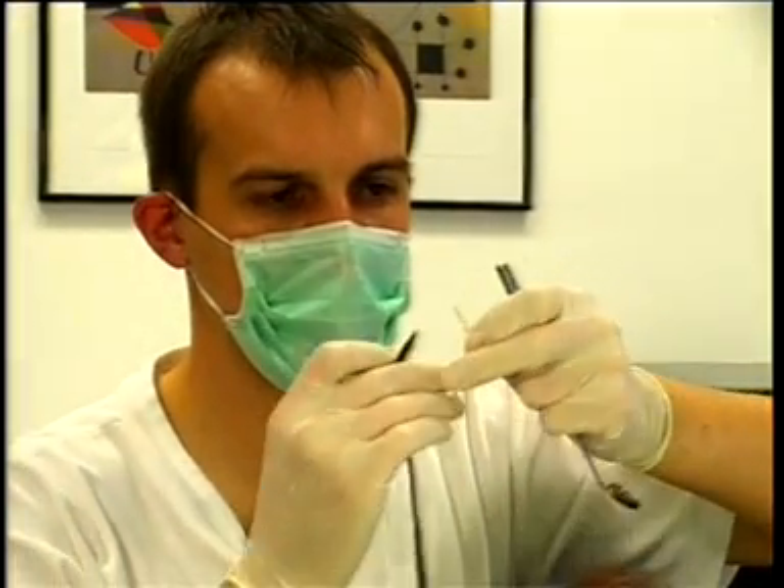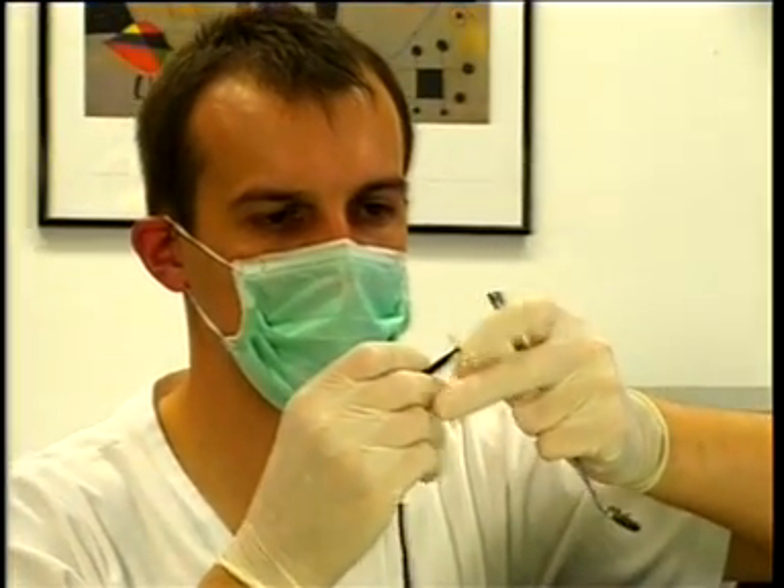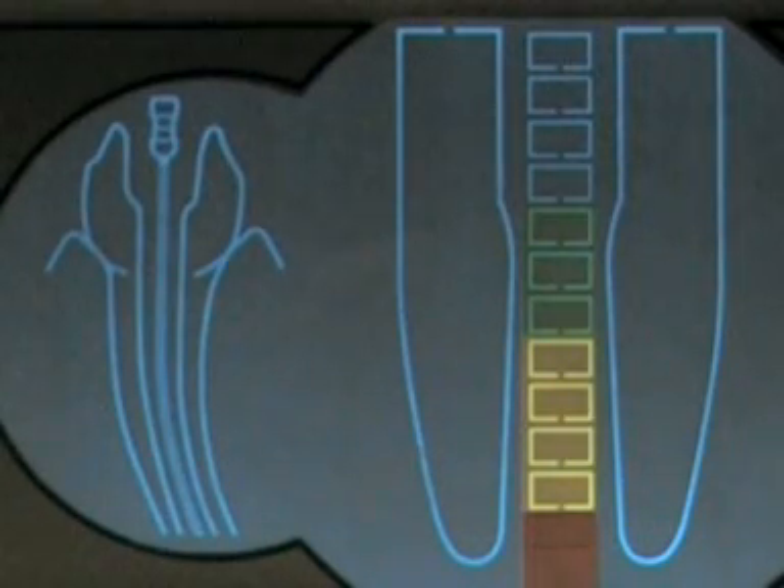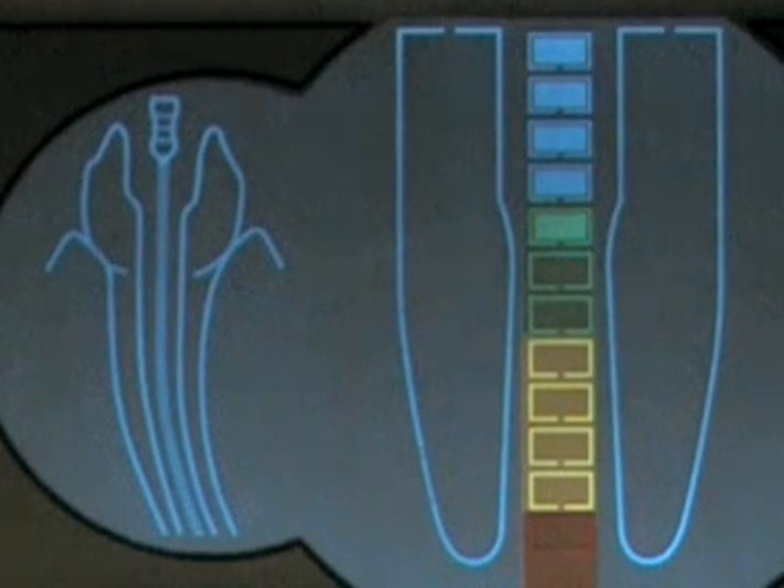Connect the file clip to the file ISO size 15 and start measuring. On the display, we can follow the progress of the file in the root canal. The coloured apex zoom is activated. When the instrument tip reaches the green section, we have arrived at the apical constriction. This is where we determine the working length.